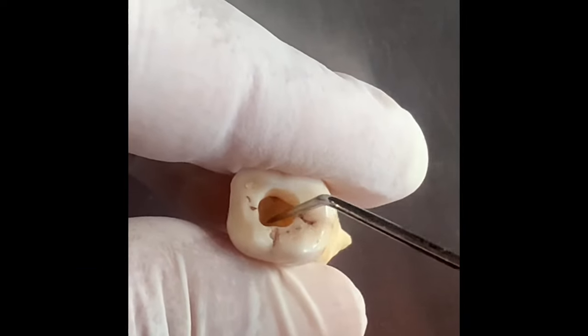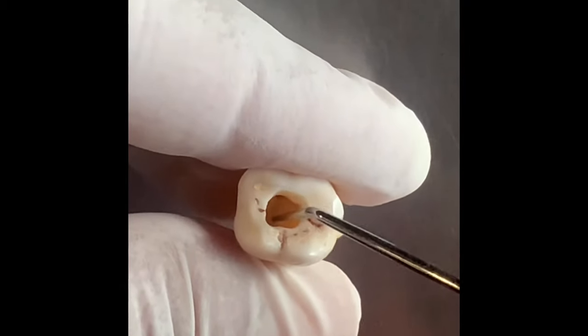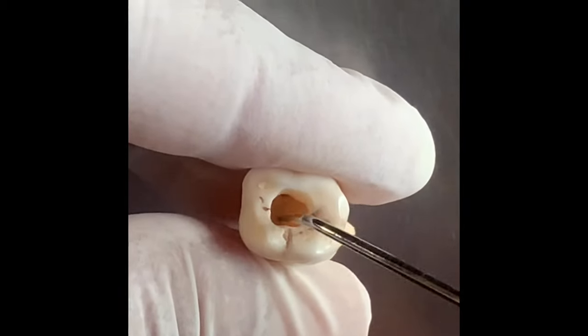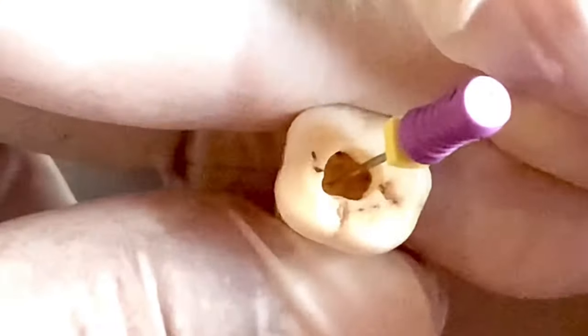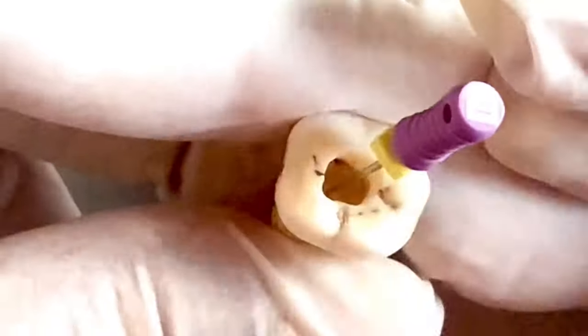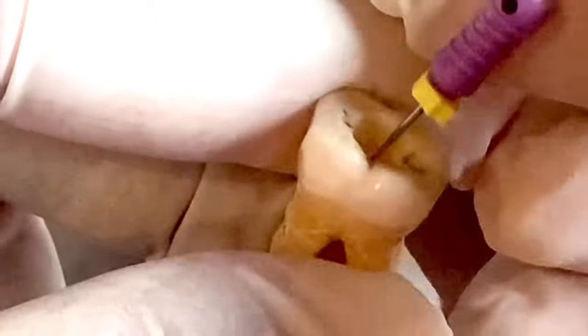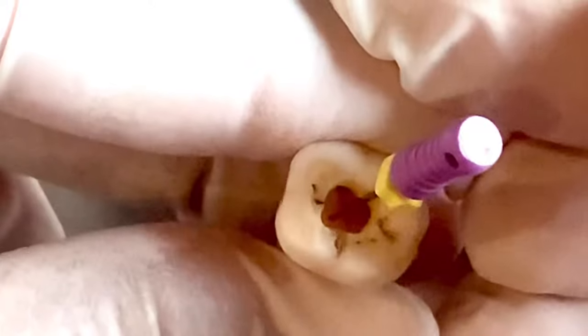Now this is the mesiolingual orifice — we will try and enter with the help of a file. I have taken a size 10 file and with gentle to-and-fro motion I will enter deeper into the mesiolingual canal. With this canal, the orifice was not calcified and I did not need the help of glide to enter here.